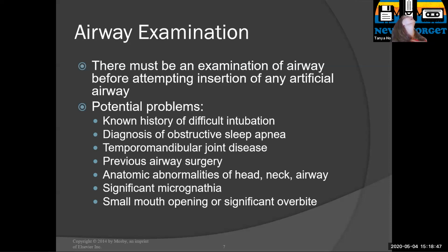So if they can't do this, then it's going to be just more difficult because now you're trying to get the airway in like this. And if you look here, the curve is like this. So anything that prevents you from structurally being able to extend the head and the neck is going to be difficult.